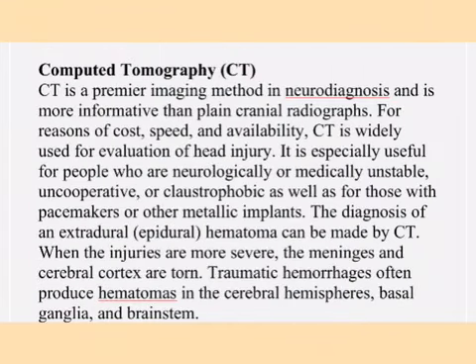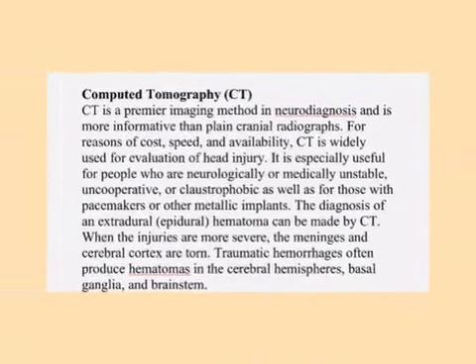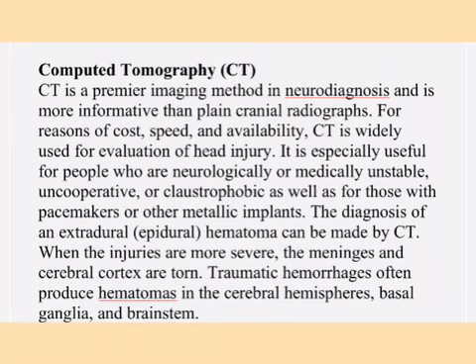Now let me talk about computed tomography. Computed tomography is a premier imaging modality that's useful in neurodiagnosis, that's diagnosis of neural abnormalities, and it offers you more information than you have with plain radiography. But it's more expensive than the plain radiograph. We still like CT, because when you talk about the cost, the speed and availability, a CT is quite useful for evaluation of head injury.